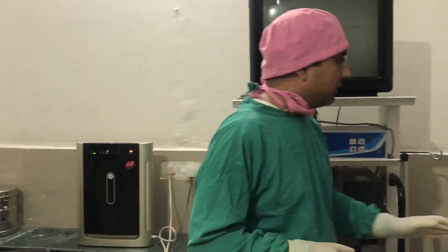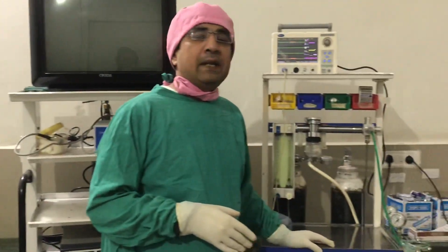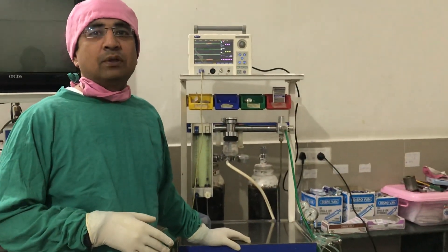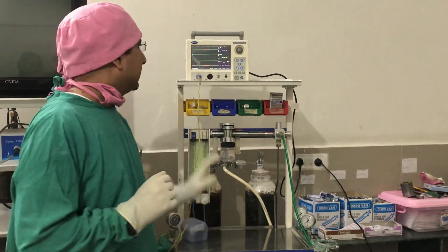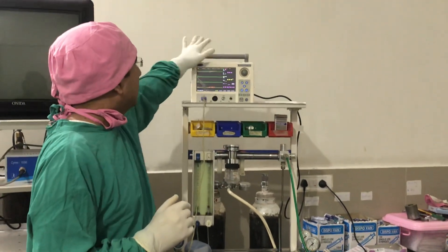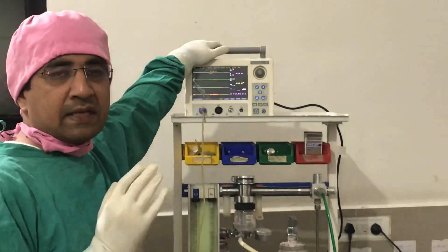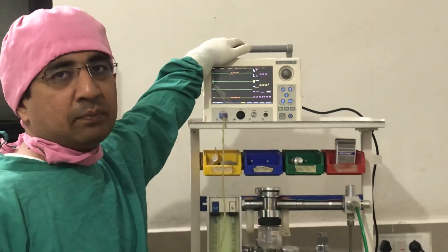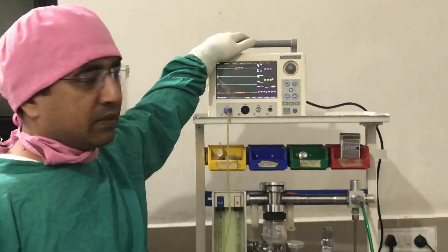I have a monitor for general anesthesia monitoring — BP, Pulse, Oxygen, Carbon Dioxide, etc.